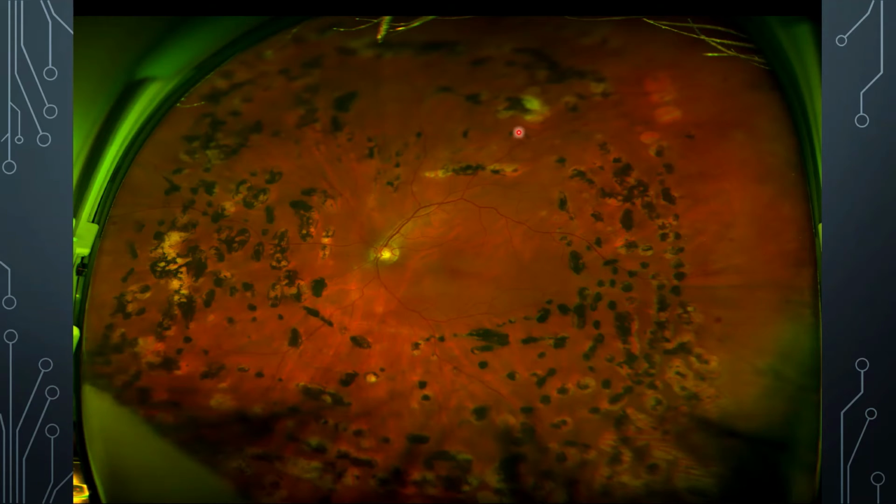This is treatment. This is called pan-retinal photocoagulation, and it's an effort to decrease the oxygen demand of the retina by zapping good tissue out in the periphery to preserve the center here where your center vision is, in the macula.